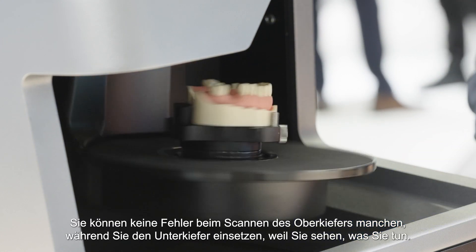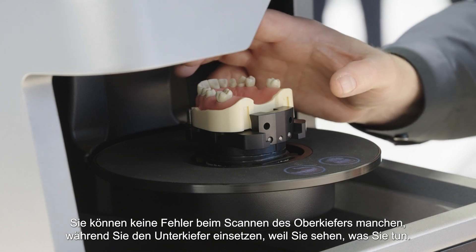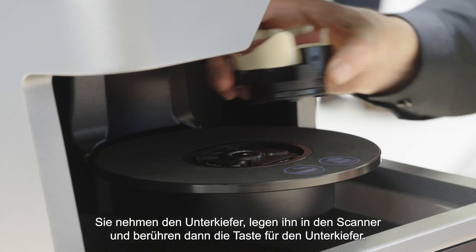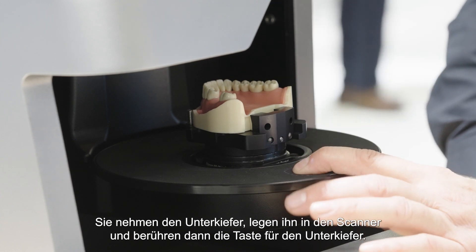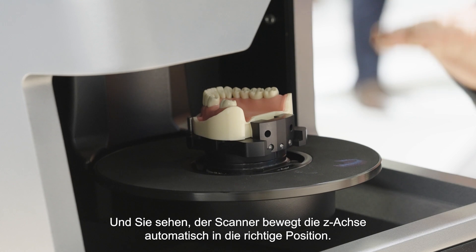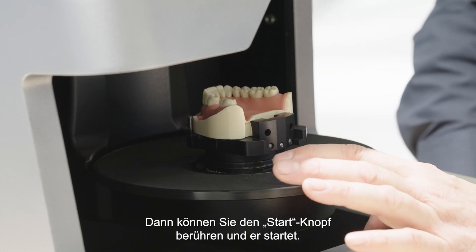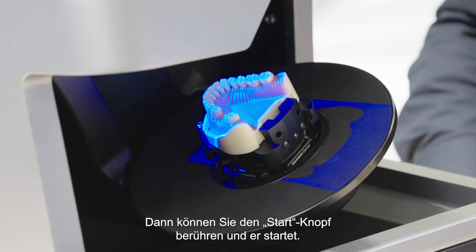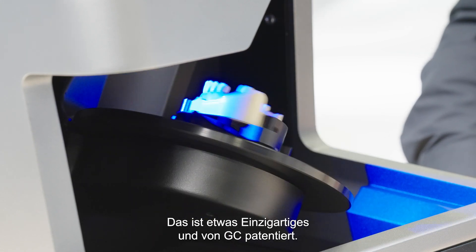It's not a failure — you can't make failures scanning the upper jaw. You put the lower jaw inside because you see what you do. You take the lower jaw, put it into the scanner, and then press the button for the lower jaw. You see it will automatically move to the right place in the ZX. Then you press the start button and it starts to move. That's something unique and patented for GC.